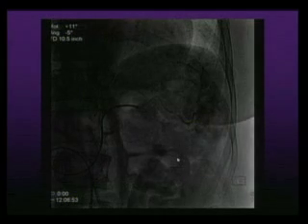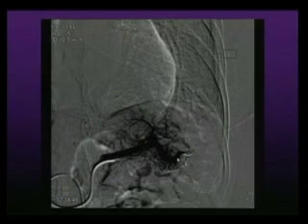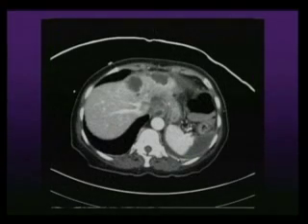So here we actually embolized the lower pole and dropped some coils. This is post, and you see there is a difference here. What has happened to these tumors? They had such a good result from this that they called me back to treat this tumor also. So we treated this first, he got his systemic chemo, then I came and did chemoembolization for these tumors too.